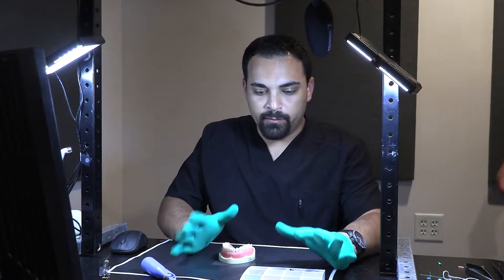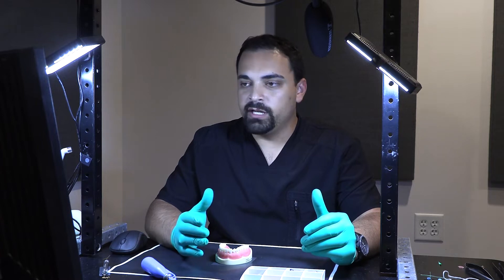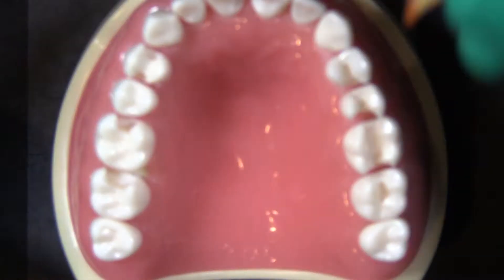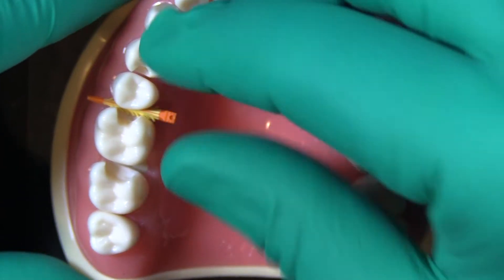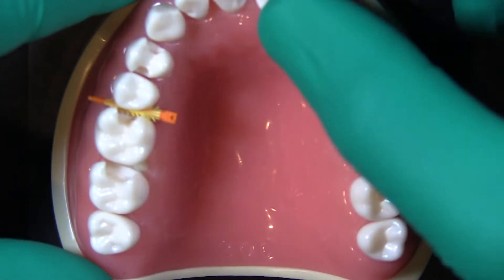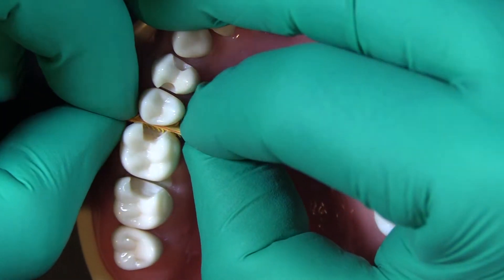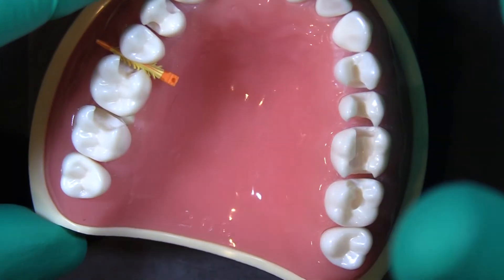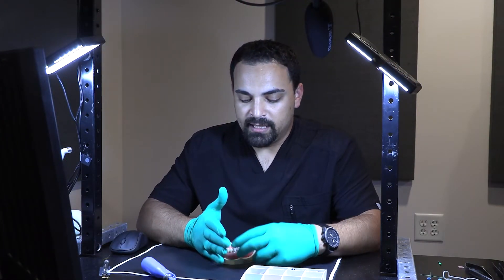Step one for me is to pre-wedge, and pre-wedging is going to go a long way in determining what needs to happen for this restoration to be successful. If this was on a tooth I had not prepped yet, I'm going to put a wedge in and then do my preparation — it tells me how deep I can prep without the wedge getting in the way. We want the wedge pushing our matrix band up against the margin of the tooth to get a seal.